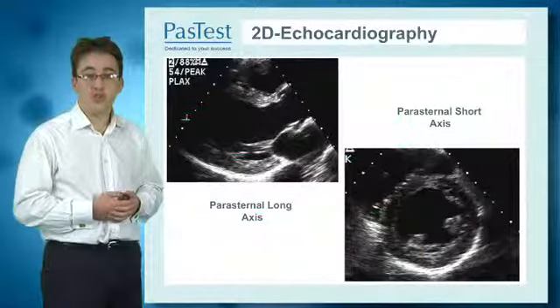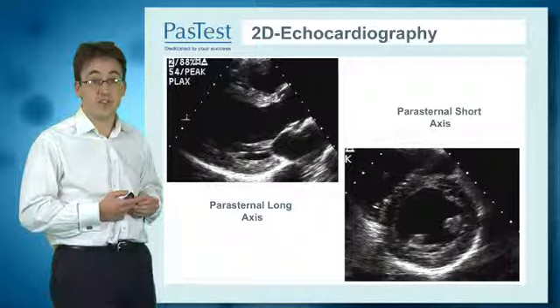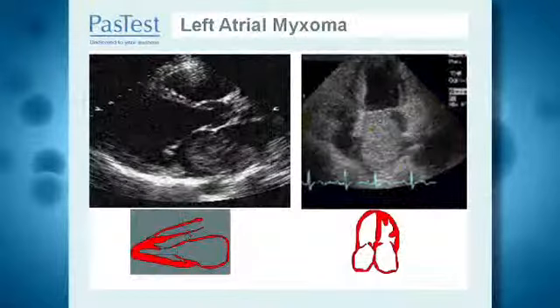Here are two normal 2D echocardiographic images. On the left is a parasternal long axis view, and on the right is a parasternal short axis view. You can see the clear and beautiful definition of the left ventricular lumen. You can see the mitral valve, the left atrium, and the aortic outflow tract. If you turn the probe through 90 degrees, to get a cross-sectional cut, or the parasternal short axis cut, you can see the left ventricle en face with the 2 mitral valve annuluses.